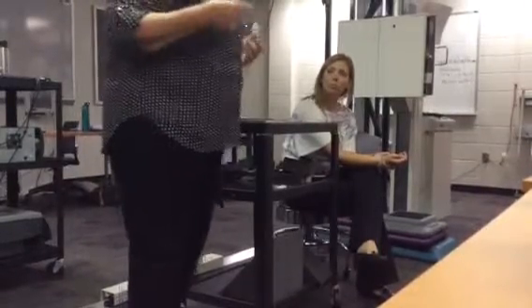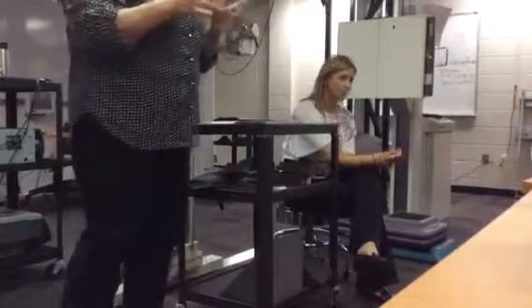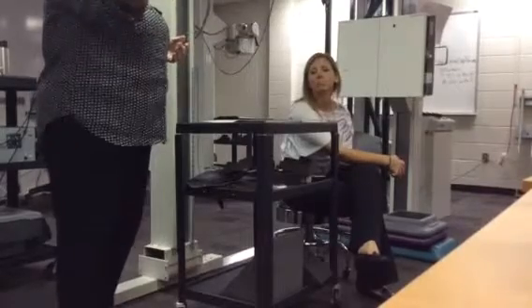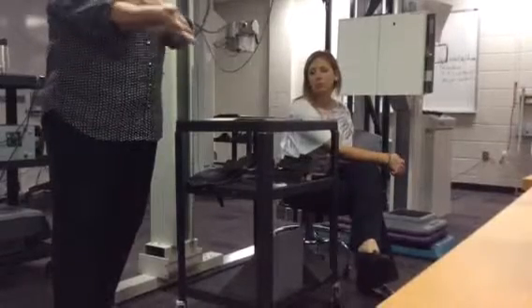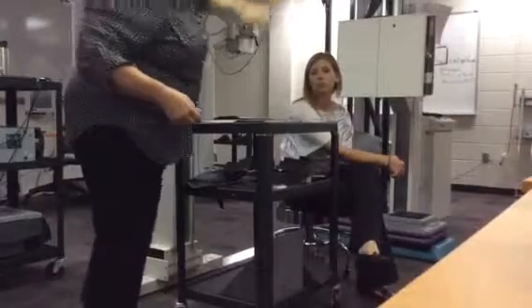Now that means I'm not going to give you a specific point to put the central ray, and I have on everything else we've done. I've told you exactly where the central part of the beam goes. But with the forearm, it depends on which joint you're trying to see. So obviously if you're seeing the wrist, it's going to be closer to the wrist. If you're seeing the elbow, it's going to be closer to the elbow. So this is really important with the forearm that you prepare your space first.